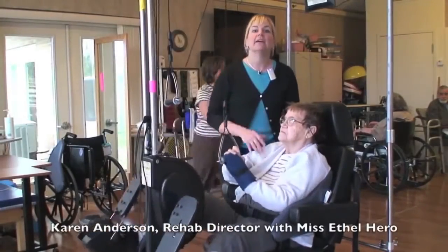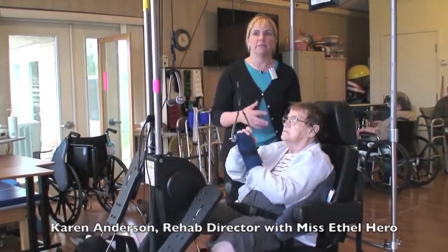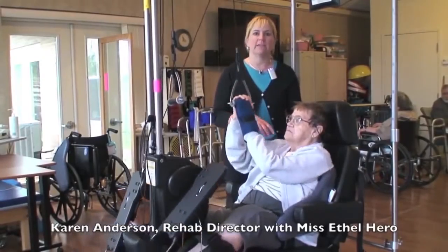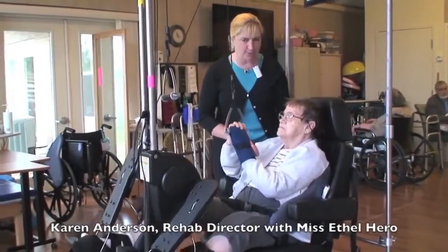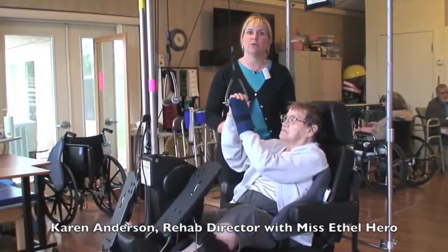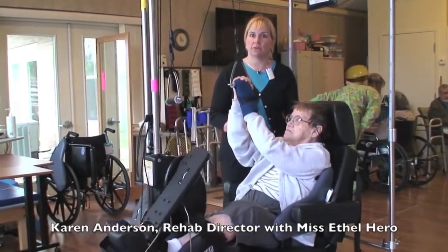In the nursing home setting, a lot of times there are people who can't tolerate a lot of activity and need to build up their endurance. It's great for that, and great for coordinating both sides of the body. This is Miss Ethel Hero — she's a wonderful lady. She had a stroke, and after a stroke, you often can't focus on the weaker side of your body, which was very difficult for her.